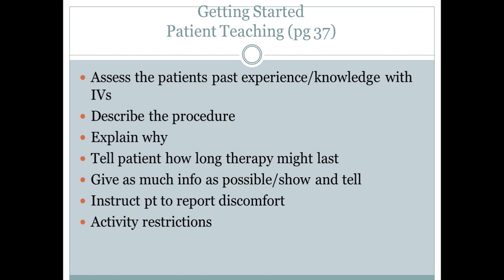So many times, depending on your facility, of course, you don't want to be wasteful, but if you have an extra catheter where the needle has been disengaged, show them that catheter. Obviously use educational and age-appropriate language. When I worked with kids, I referred to that plastic catheter sheath as a straw, and that it's your body using the straw to drink that IV fluid coming from that bag. And again, you want to use those terms and the words that are age-appropriate and educational level appropriate for your patient. So then I'm going to describe the procedure.